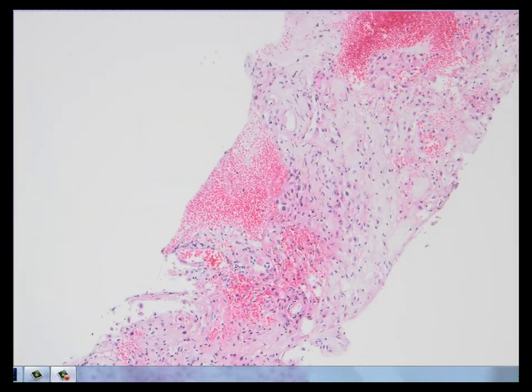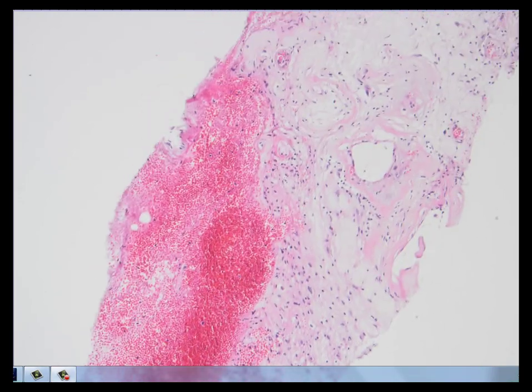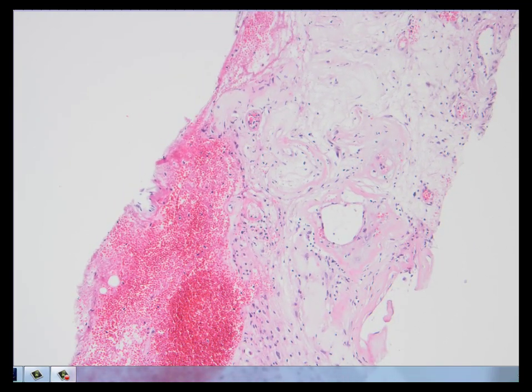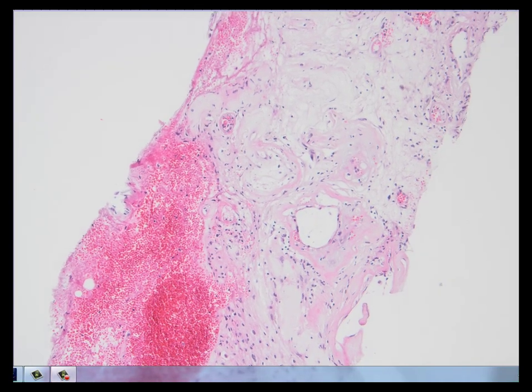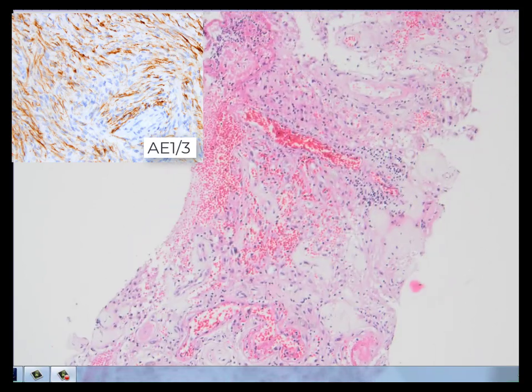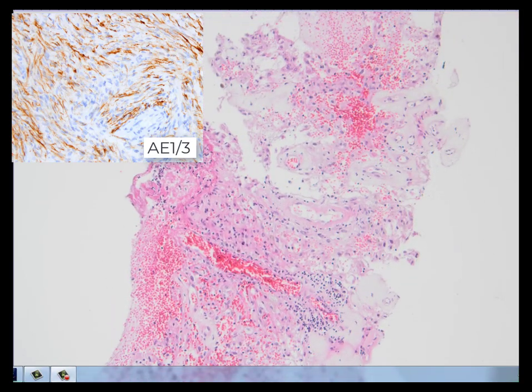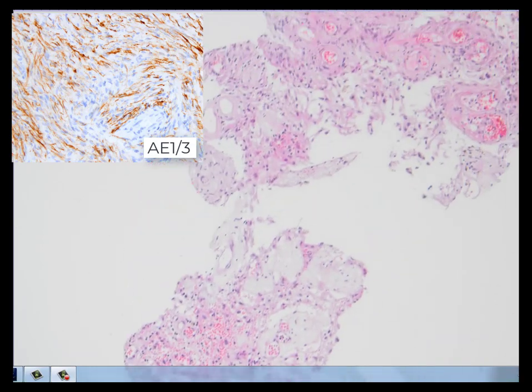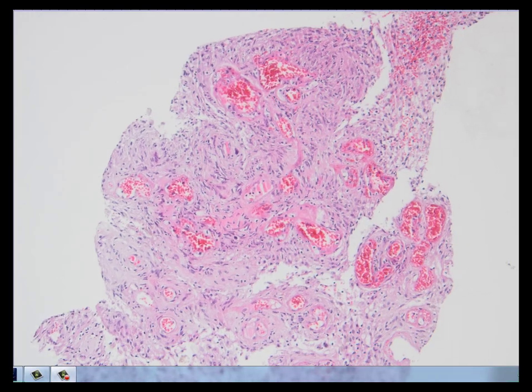So actually the morphology is pathognomonic and diagnostic for schwannoma. If you do a cytokeratin here, you may mess up the diagnosis, because AE1/AE3 cytokeratin may cross-react with GFAP and therefore may be focally positive.